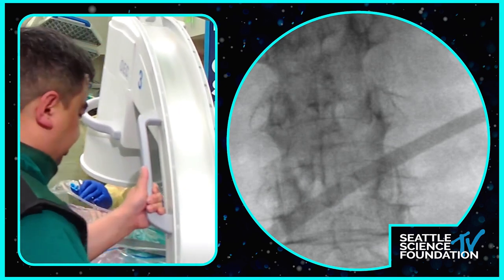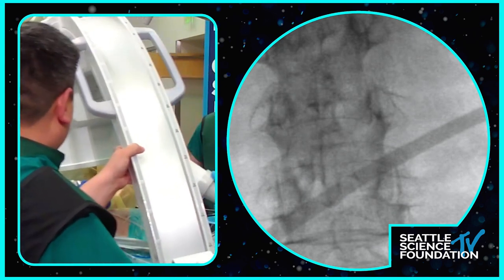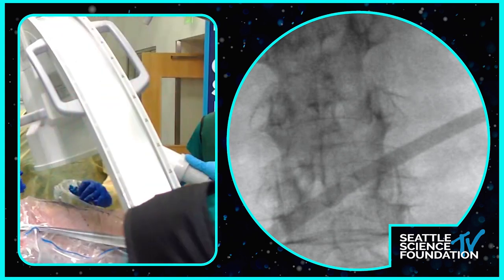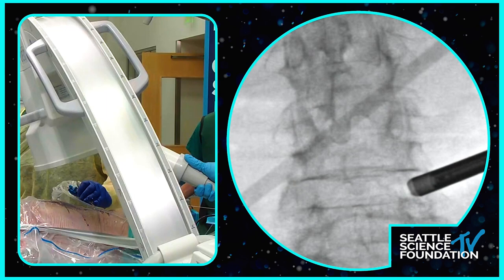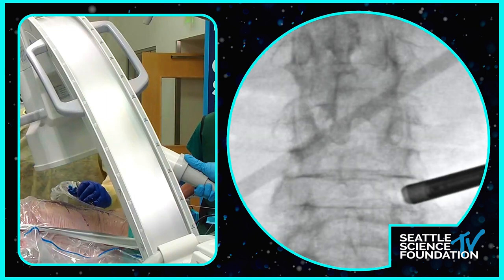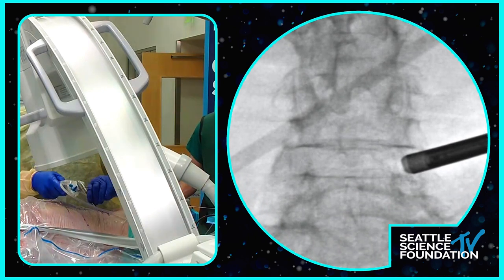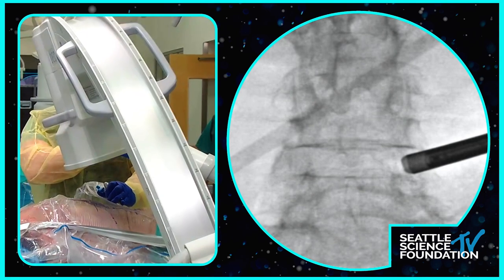And Ray, can you take one more AP x-ray because we couldn't see the last one you took? Yeah. So you saw the lateral, right? Yeah, lateral's good. Okay, we'll get an AP here. You see the AP kind of over the top of the pedicle? Perfect. So as that implant advances, it should end up medial wall of pedicle to medial wall of pedicle. So I can actually advance my cannula into the disc a little bit here. And give me a shot there, Grasper.